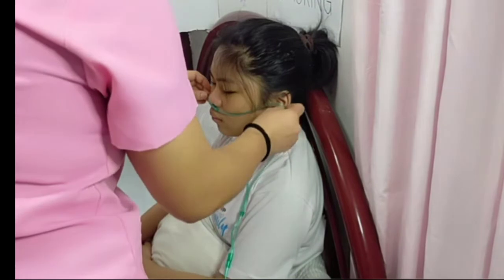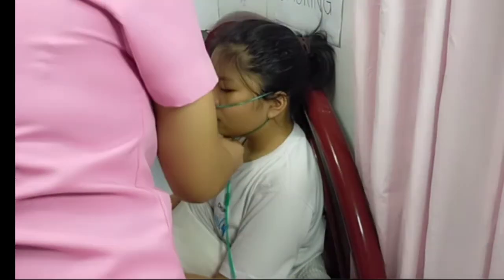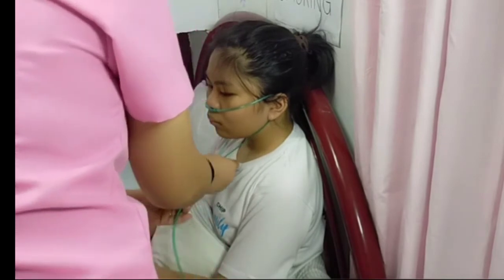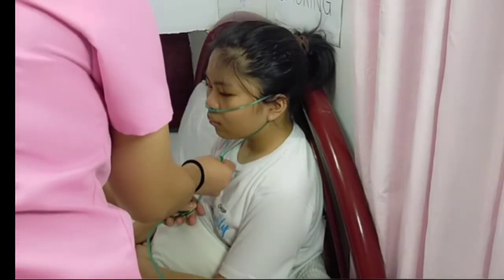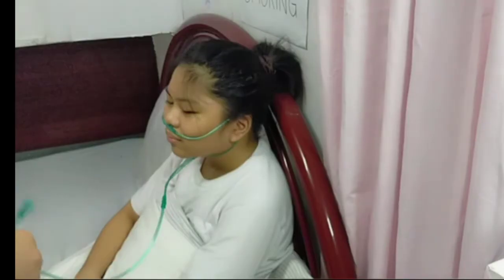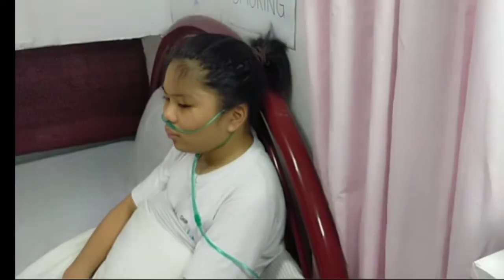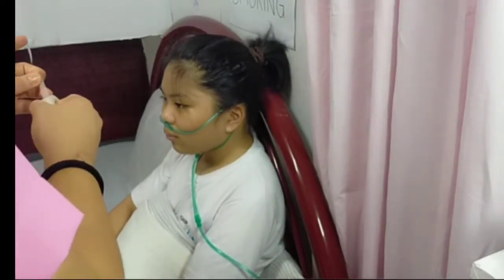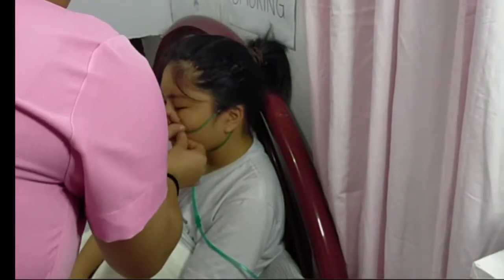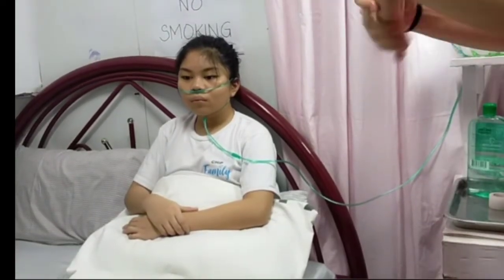Slowly attach the 2 nasal prongs to the patient's nose. Anchor the 2 nasal tubes behind the patient's ears. Secure the nasal cannula by sliding it up to the patient's chin. Attach the end of the cannula tube to the oxygen outlet. Open the flow regulating valve and regulate according to the doctor's order.